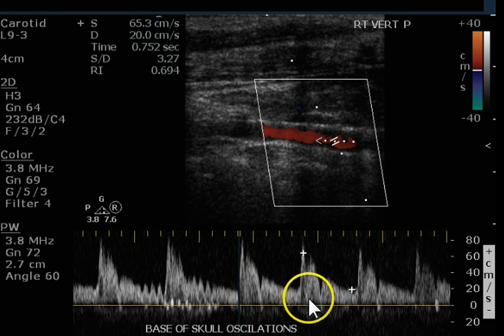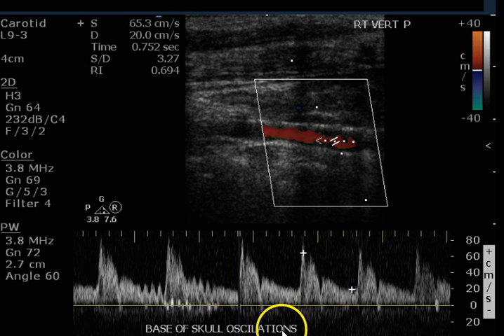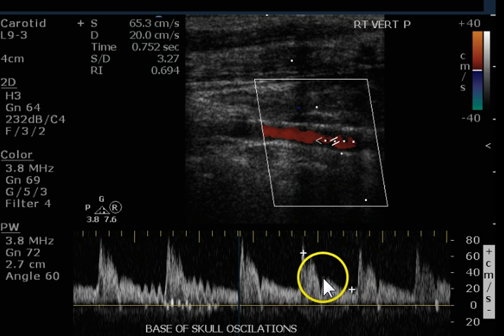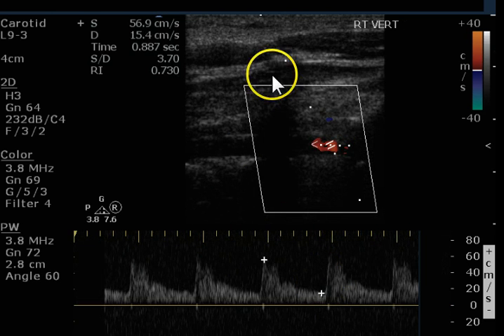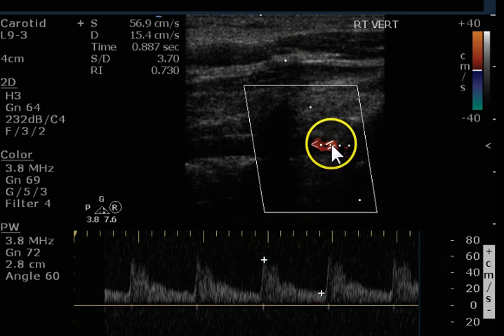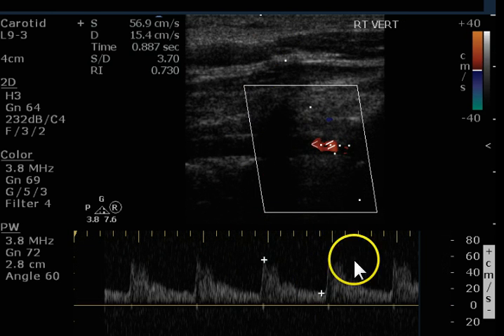The right proximal — they're doing base of skull oscillations, but there's no reason for this. We can see a vertebral signal and we know this is a vertebral artery.